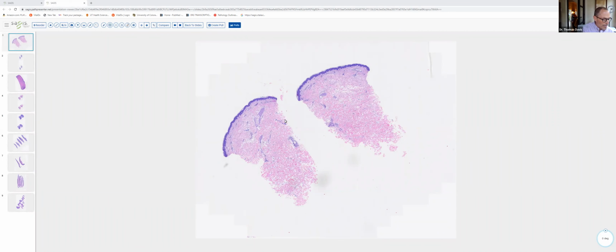So we're going to be rounding out our series on Dermpath essentials this week with an actual practice session. We have 9 unknown slides, and I tried to pick slides of varying degrees of difficulty, so those of you who are upper levels could work through them as well. So without any further hesitation, we will go ahead and get started.